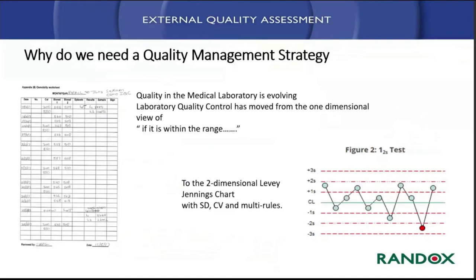As I said, we've had experience of errors and different situations around the world. I've been involved in external quality assessment for about 28 years now. I've traveled the world with Randox, traveling to different laboratories. And it's not that long ago that I've come across situations like this on the left, where you're simply looking at your internal QC being jotted down into a book. That's quite difficult then to be able to see a full picture. That has progressed remarkably over the last number of years. Certainly when you look at the image on the right, you should all be familiar with this.